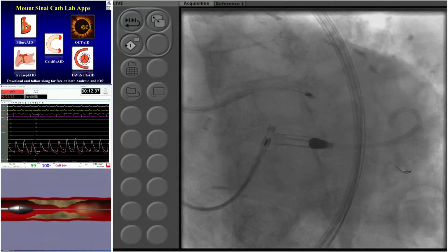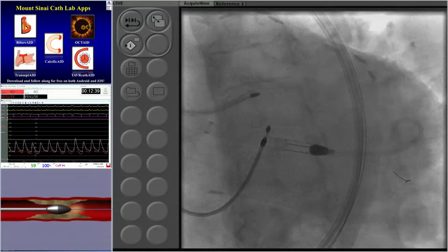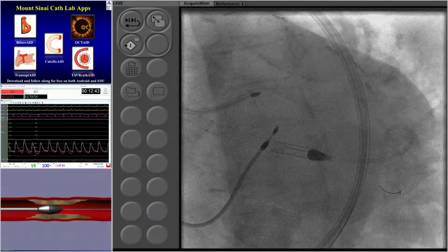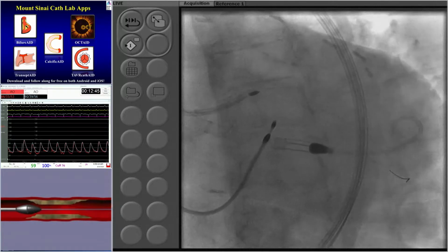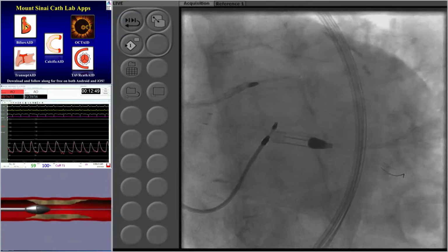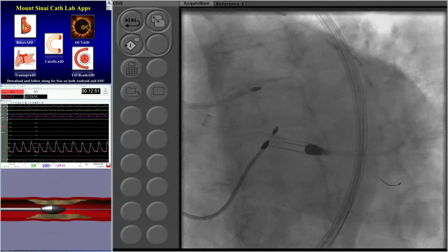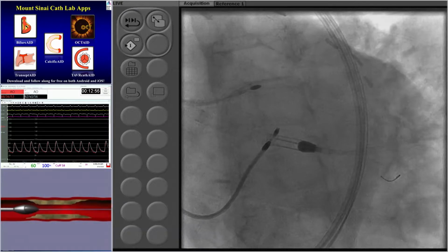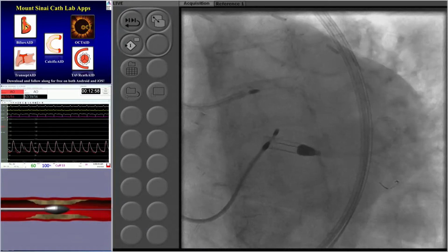Show the hemodynamics. The blood pressure has gone down even with the Impella to about 80. Yeah, let's go with the Neo, please. Give the Neo. Although with the Impella, it's less important because part of the blood is being ejected by the Impella, but the key is that from 180, the blood pressure has gone down. So let's finish the polishing of the left main and circumflex.